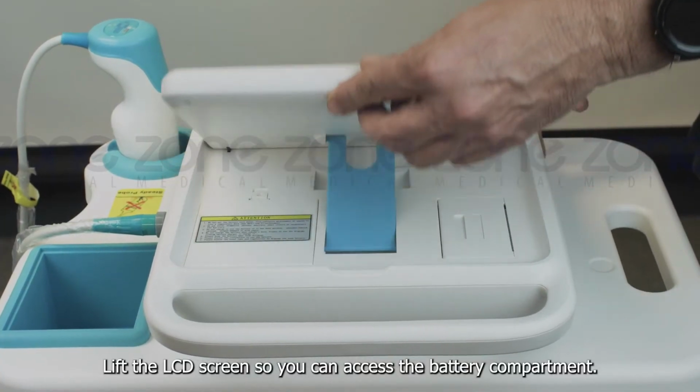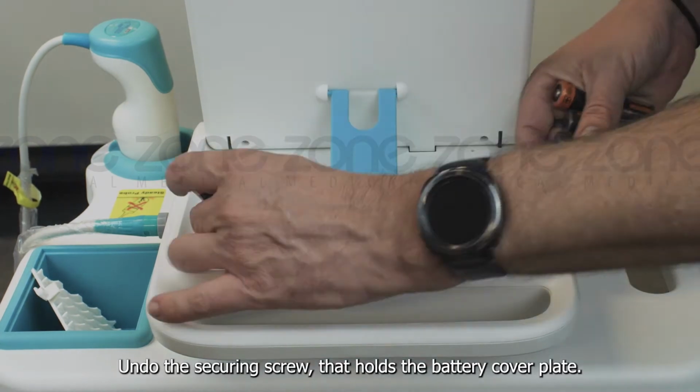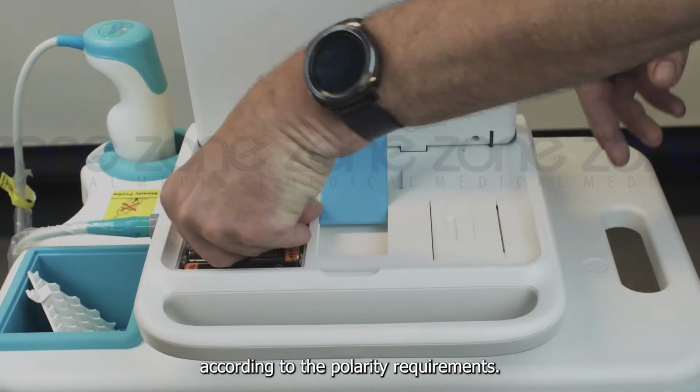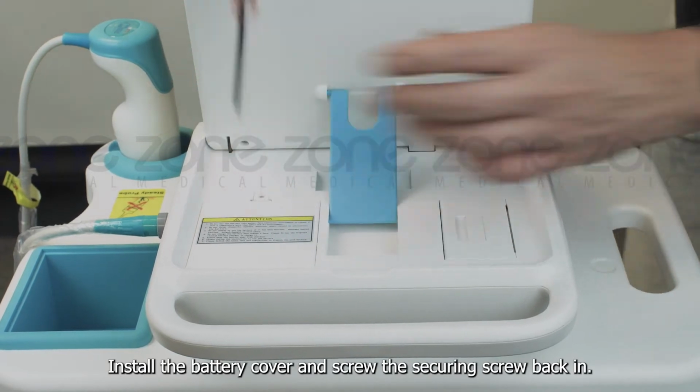Lift the LCD screen so you can access the battery compartment. Undo the securing screw that holds the battery cover plate. Put in the supplied batteries into the battery tank according to the polarity requirements. Install the battery cover and screw the securing screw back in.